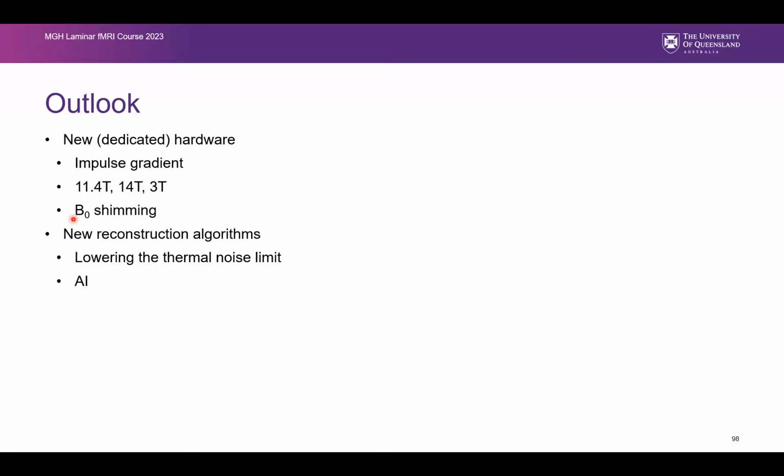So the question is about macrovascular weighting as a function of field strength. Sorry, Zoom people. The question was how the weighting of macrovascular and microvascular signal changes across field strength. This is a complex one. You have microvasculature and macrovasculature, but then you also have extravascular and intravascular signal. And at higher field, basically the intravascular signal is gone.